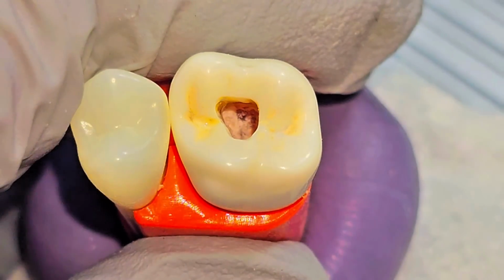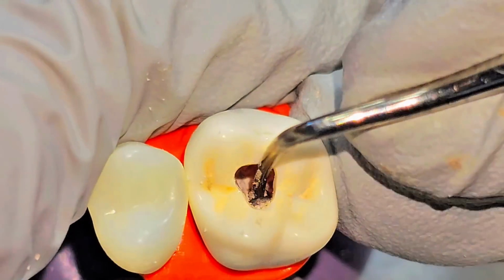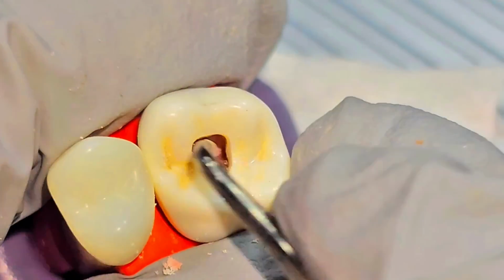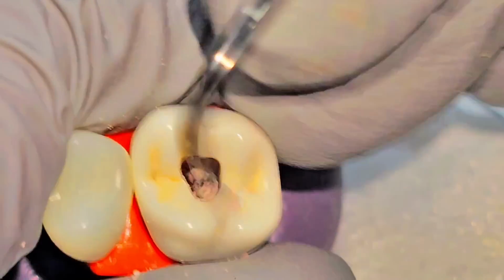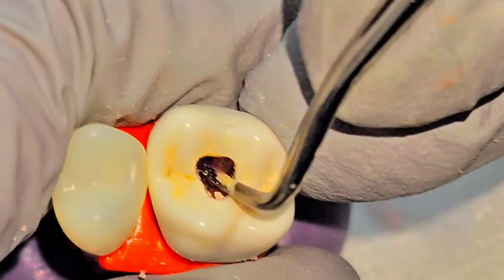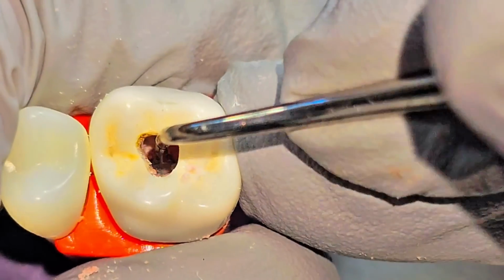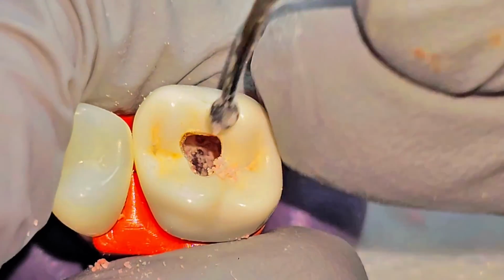Alright, let's check one more time. So as you could see in the video, when I was working with the 330, it just stops as the shank cannot go further down, because the width of the 330 burr is smaller than the shank, stopping at 5 millimeters.